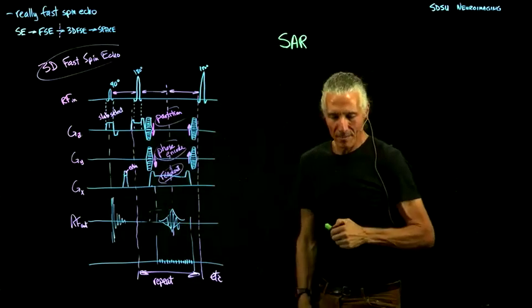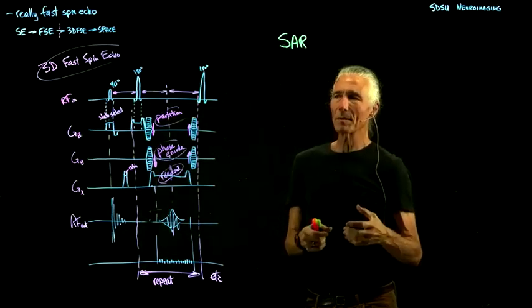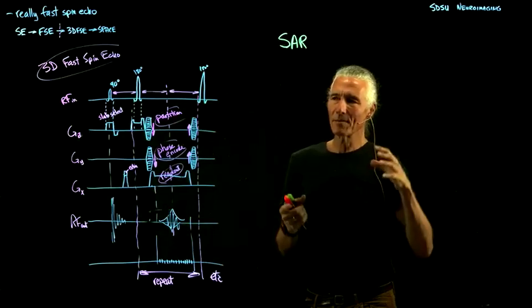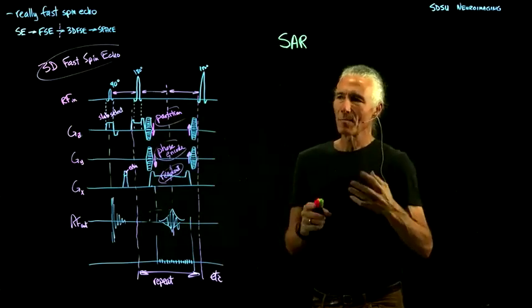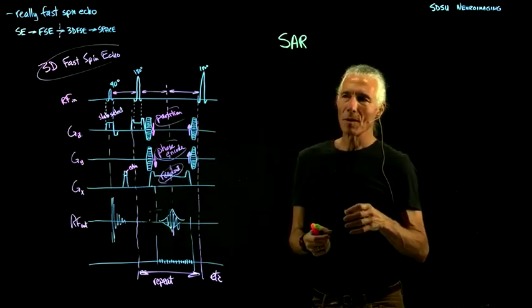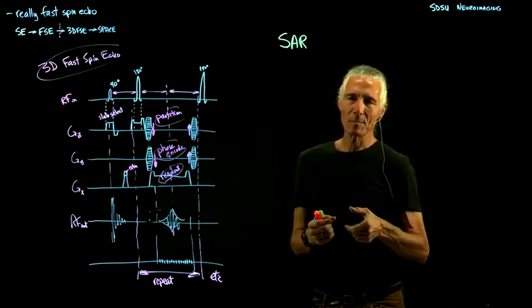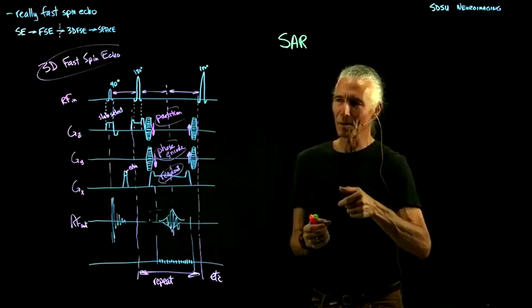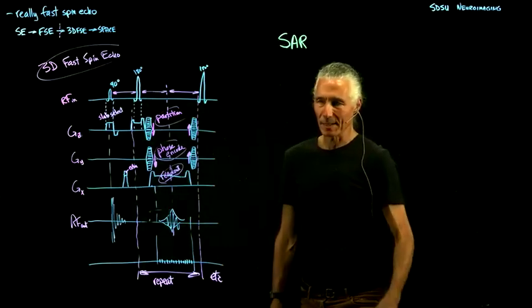So how does the scanner actually measure this? The scanner directly measures how much RF has been absorbed. There's an antenna, another little detector inside there. If you do an RF pulse, turn on the transmitter, that will generate some radio waves. They'll go into the head, and a certain percentage of them will be absorbed and will affect the spins and invert some of them. At the quantum mechanical level, it'll flip some so that they're in the opposite orientation from the B0 field, and it will line up their phases.